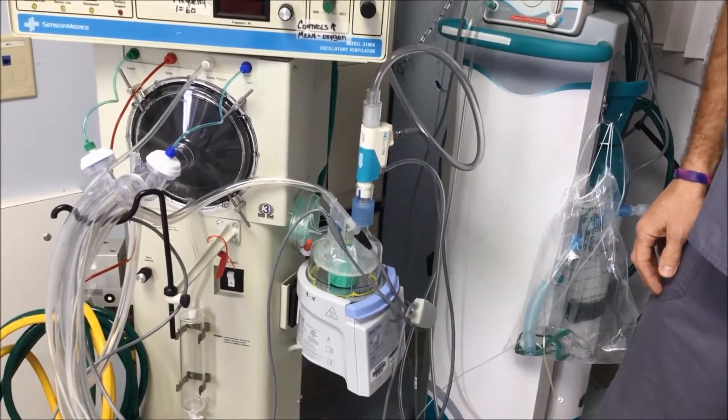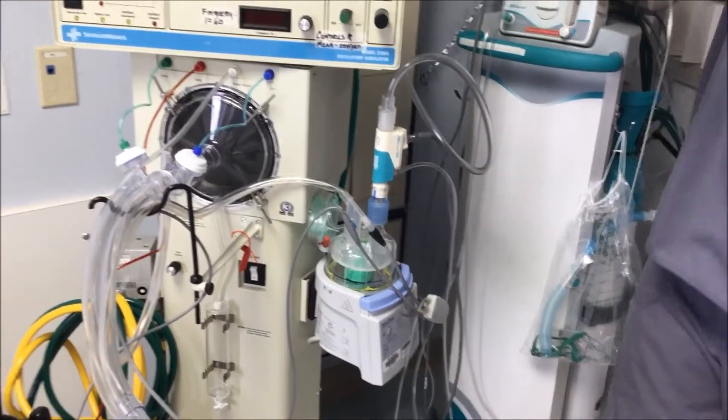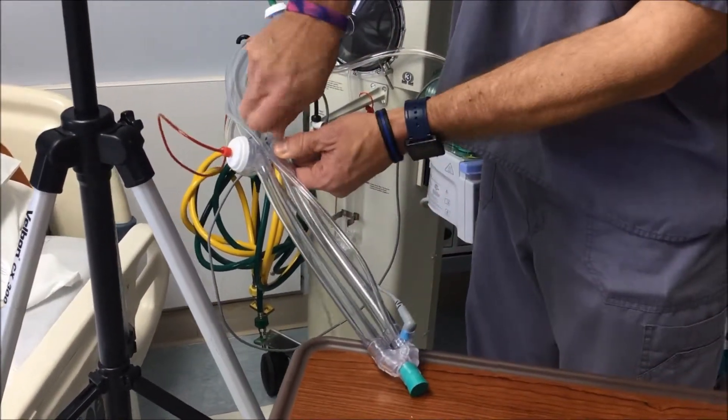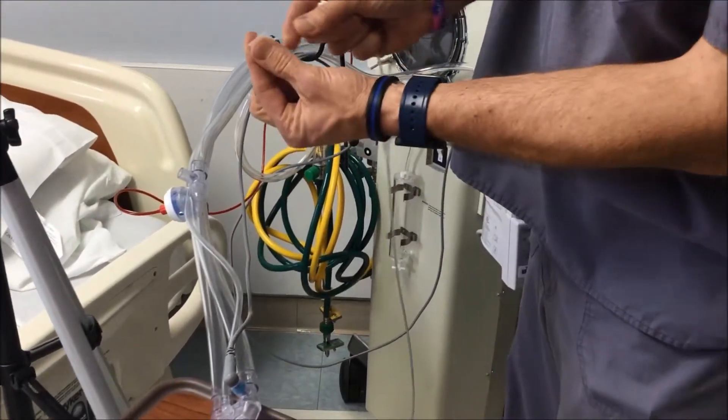That's how the injector module hooks in line with your circuitry. Now for your sample line — grab it and connect it into your oscillator circuitry here. Simply remove this piece, and your 90 degree T, as you see here, slides into that port.